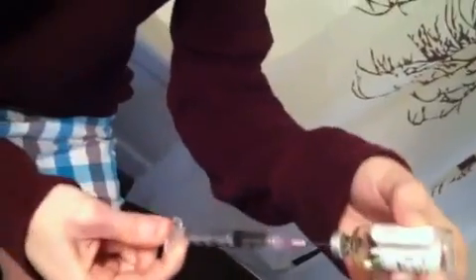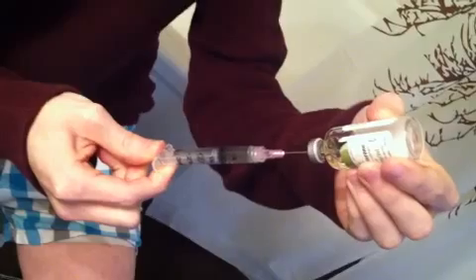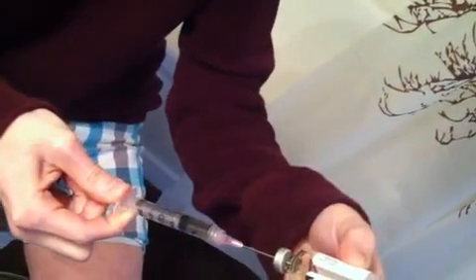Okay, so you're going to pull it out. You're going to hold the bottom of the syringe, because since the T is so thick, it wants to inject back into the bottle, so make sure you're holding the end of the syringe so it doesn't do that. And then you pull it out. You're going to pull this all the way back so that it takes the T out of the needle. And then you're going to put the cap back on this, twist it off, and put it in your sharps container. You can get these at pretty much any drugstore. I got mine at Walmart. It's like $3, and you need one to be able to put all your stuff in.